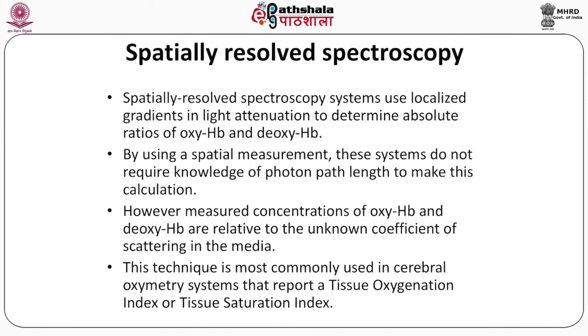This technique is most commonly used in cerebral oximetry systems that report a tissue oxygenation index, or a tissue saturation index. We will not go into the detail of tissue oxygenation index and tissue saturation index. Just remember, these are the indexes that are calculated from spatially resolved spectroscopy.